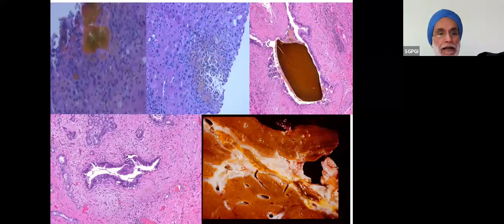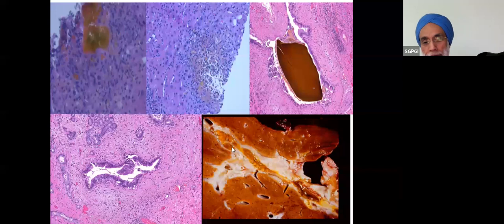And here are some examples. This is an example of a bile leak and extravasation. This is a bile infarct, an area of dropout with inspissation by bile. Here's a large microlith. A gross examination may show dilatation and stricturing. And here's periductal edema, fibrosis, and focal ulceration.